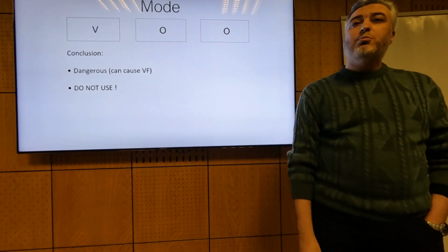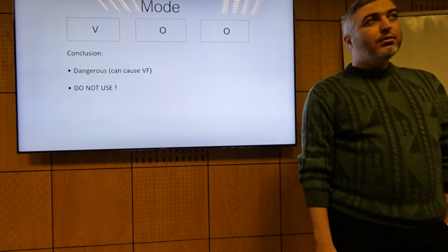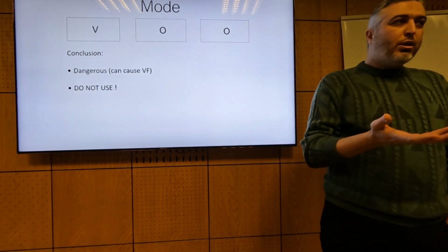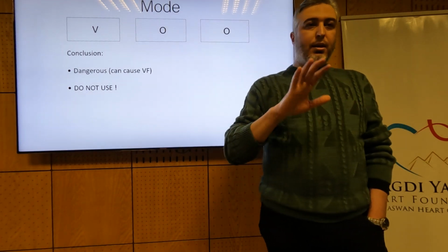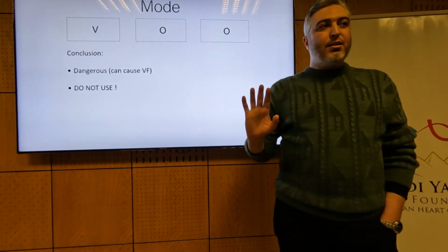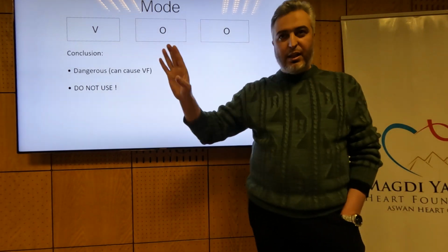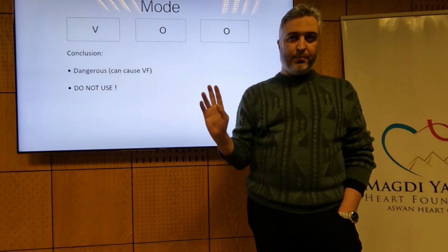So let's assume a patient has mitral valve disease, and then he had mitral valve replacement. During his mitral valve replacement, he got heart block and had a pacemaker put in. His pacemaker was adjusted to be VVI. Then essentially he required another operation, whatever, aortic valve disease, stuck mitral, whatever. He now needs another operation. So now we need to reopen the chest.